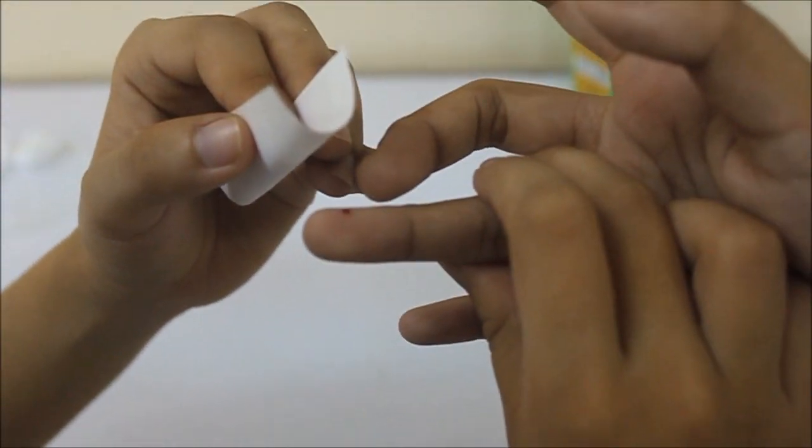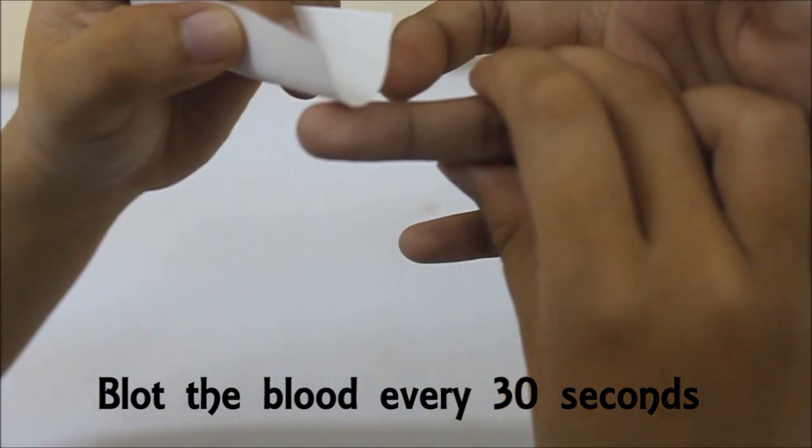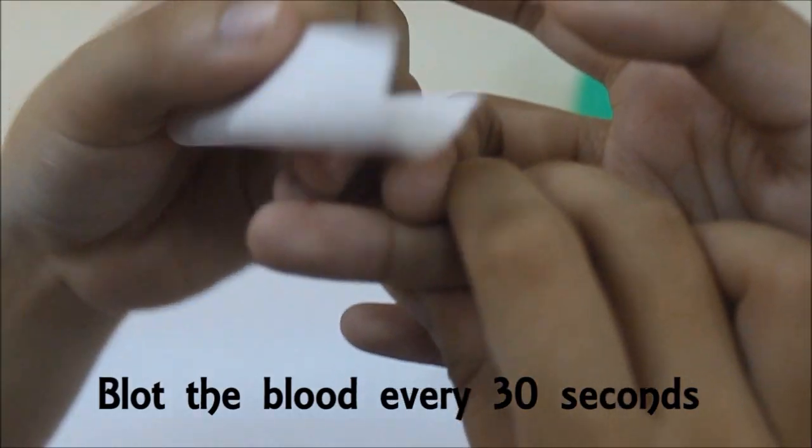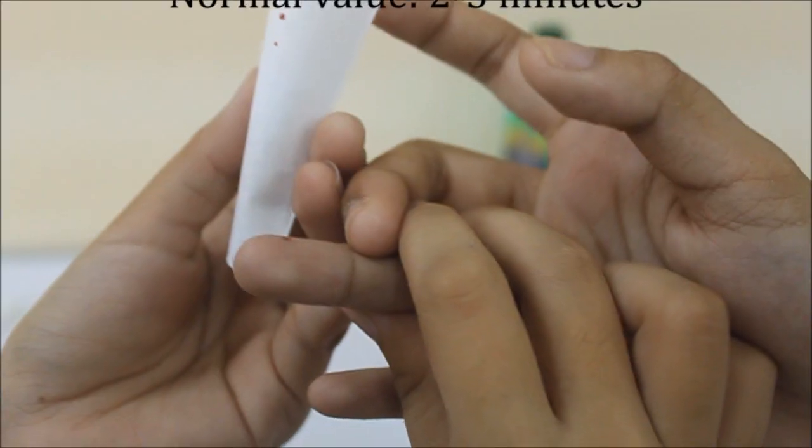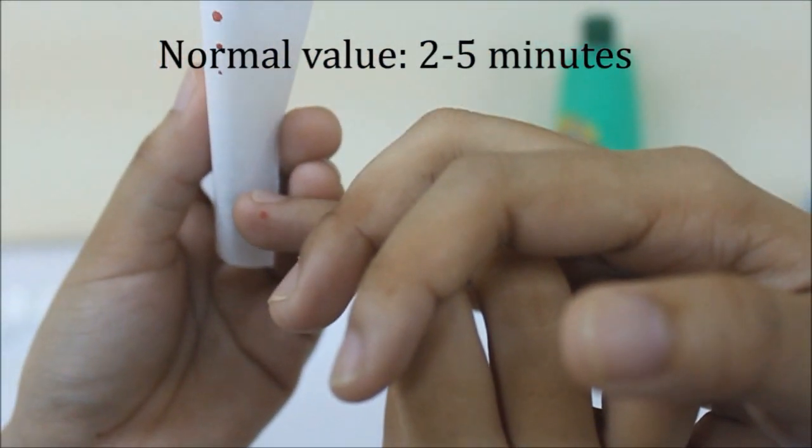Do not wipe the first drop of blood. Blot the blood with the filter paper every 30 seconds by lightly touching the edge of the blood drop. Stop the watch when the blood is no longer absorbed into the filter paper. The normal value for the Duke's method is 2 to 5 minutes.